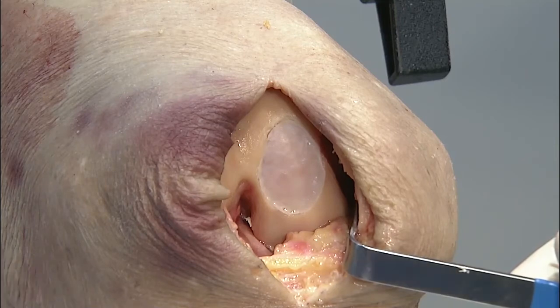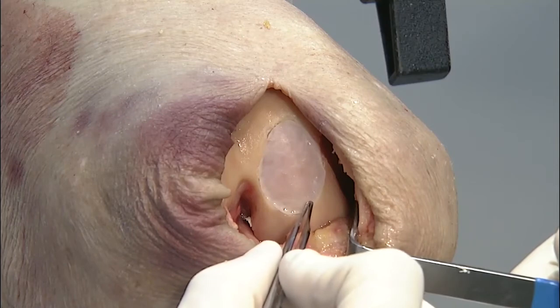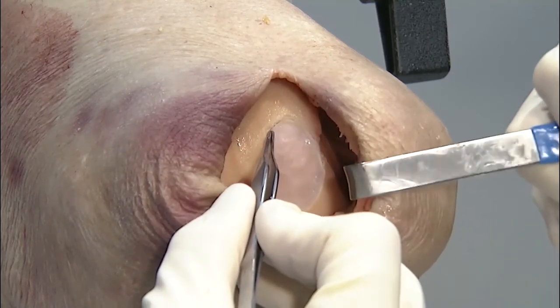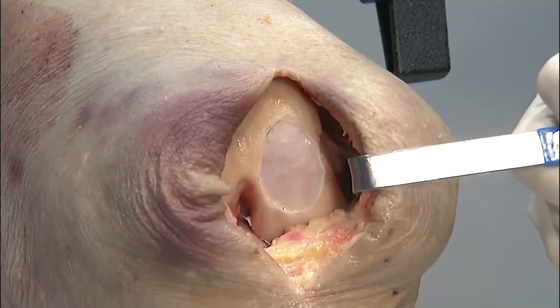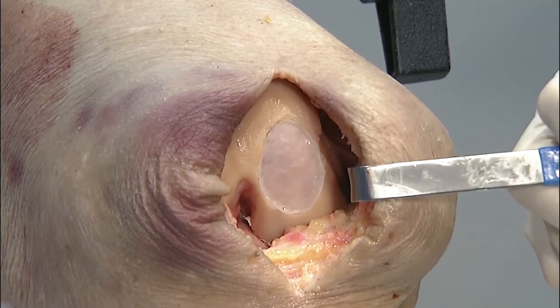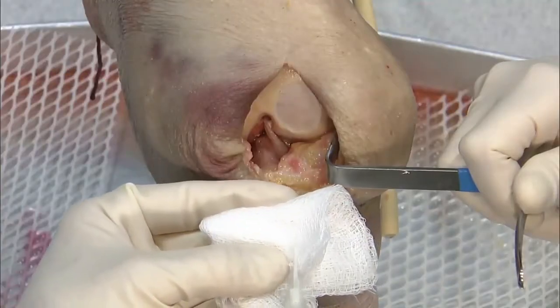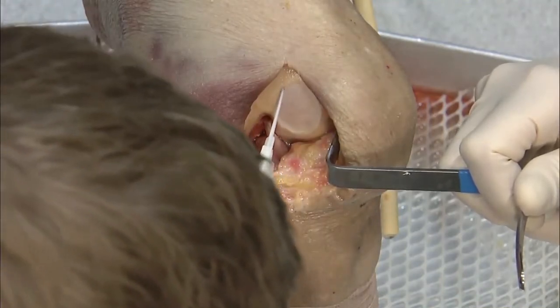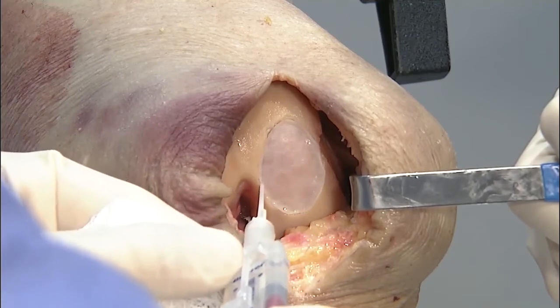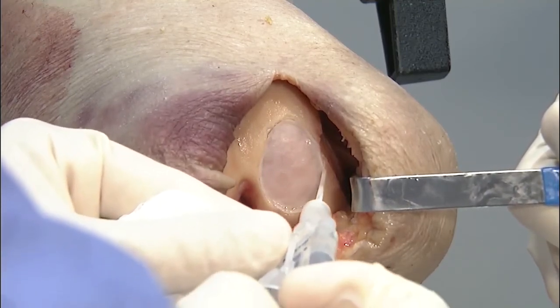So I guess we can see how we did here. Critically, I think this looks good. It's a little bit up on the wall of the cartilage, but not overlapping. I think you can see just a tiny little pink sliver here. So what we would do is add a thin layer, again, of the fibrin glue, just around the edges. You still want diffusion of those cells to occur over the top of the implant. That's important for their health. We just add a little bit here to the edge.